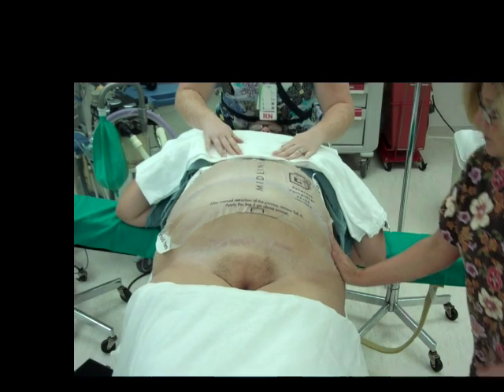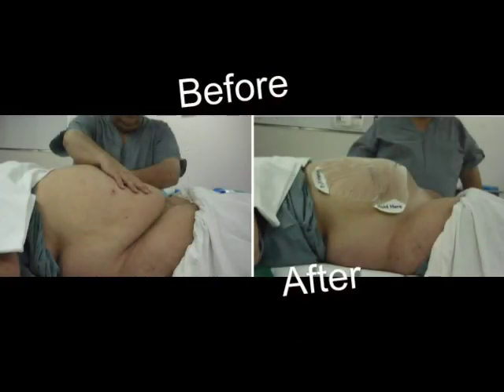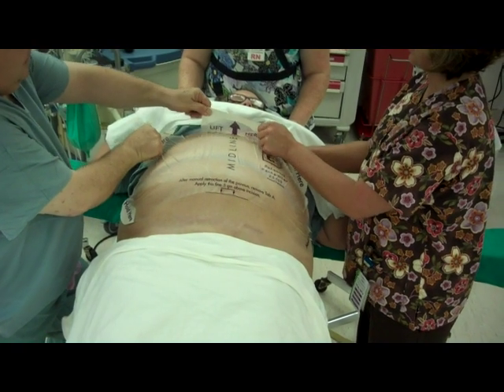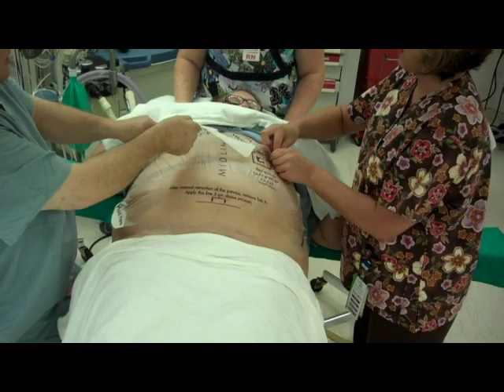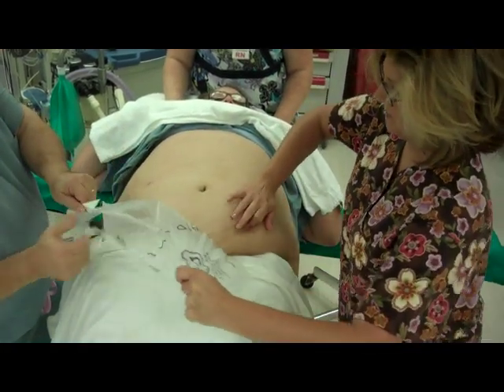We've just completed the retraction of the pannus in approximately 40 seconds. To remove, simply grasp one of the hold tabs, support the skin, and peel away the retractor.